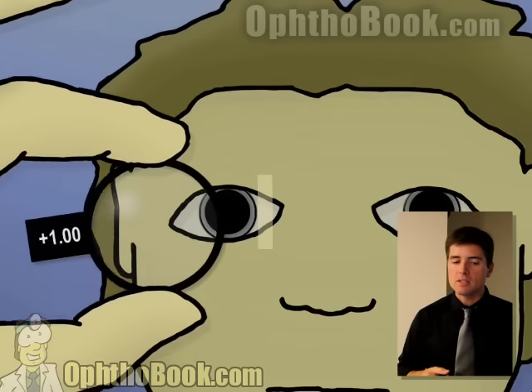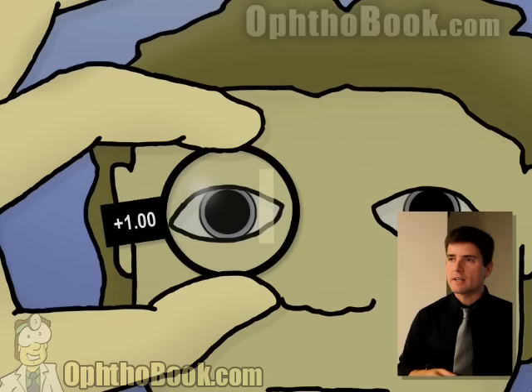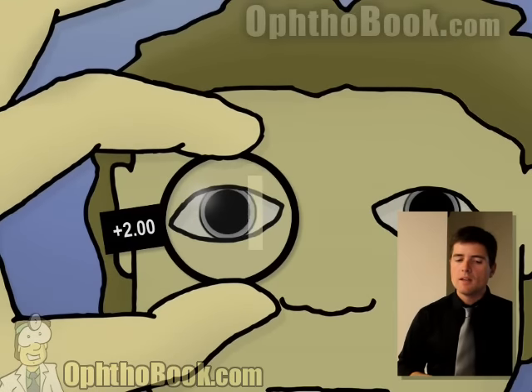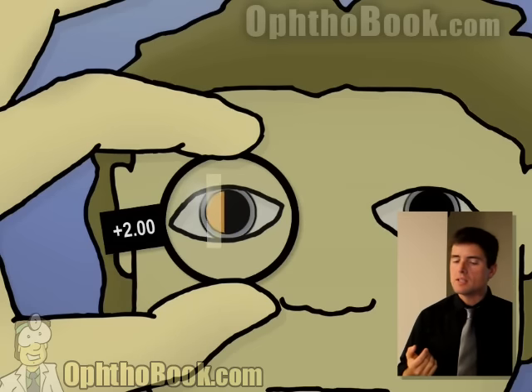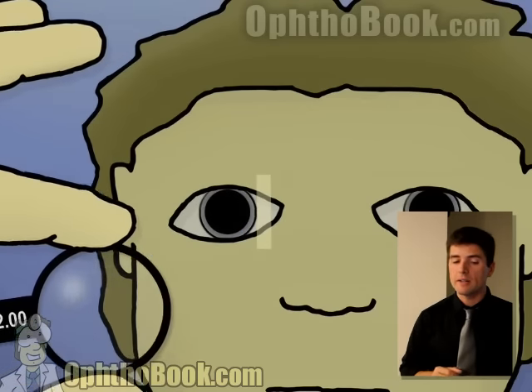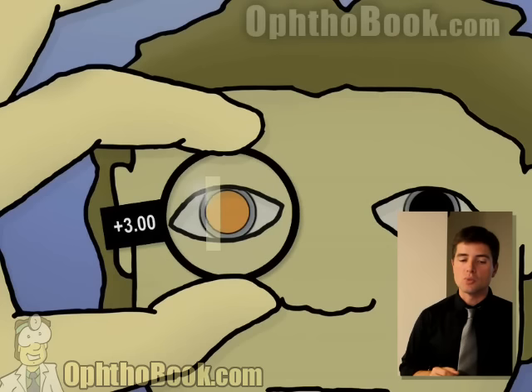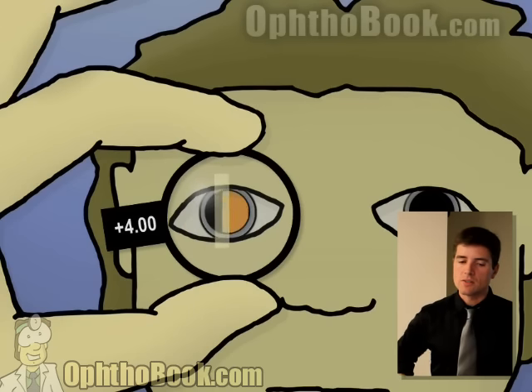Let's add a plus one to the system — we still have with motion, so this lens isn't powerful enough. Let's try a plus two — the reflection is still with, but you can see it's gotten a little bit wider, which is a good sign; when it gets wider, you're getting closer to the right prescription. A plus three — this is perfect, the right prescription. A plus four — we're too strong now, and the reflection is actually moving against us. That's not what we want. That's how you do basic retinoscopy.